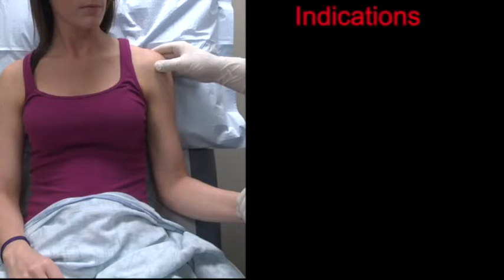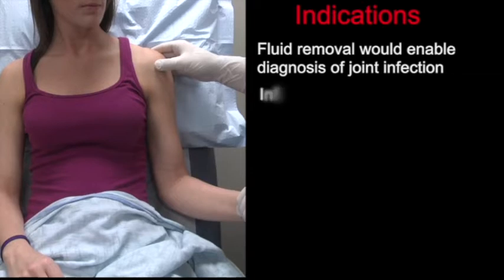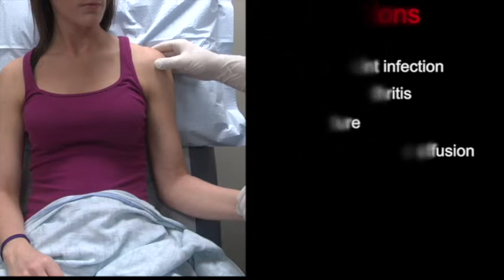Indications for arthrocentesis include any joint for which removal of joint fluid would enable you to diagnose a joint infection, inflammatory arthritis, acute fracture, or to relieve the pain of a large effusion. A similar approach may be used for injection of a local anesthetic or anti-inflammatory medication.